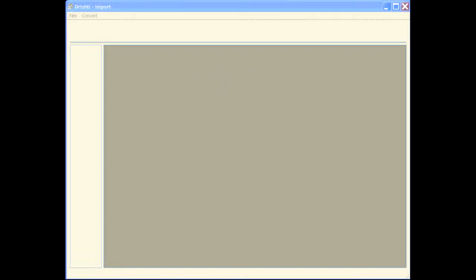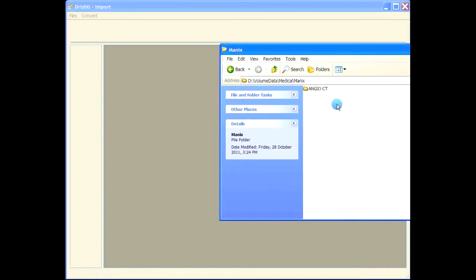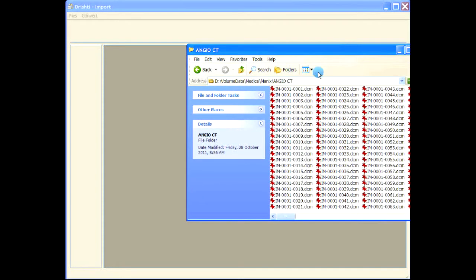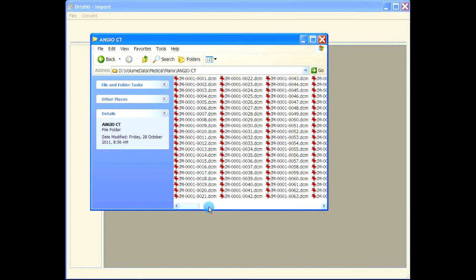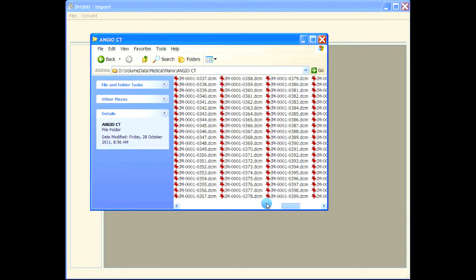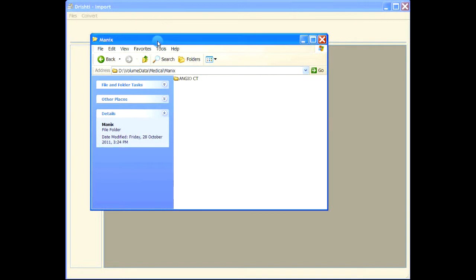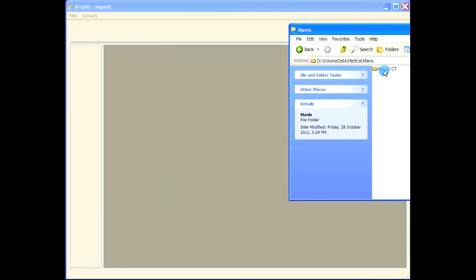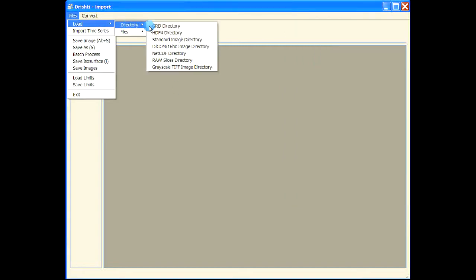This video will show you how to import DICOM image stacks. This is the image stack here, DCM files. We can either drag and drop this directly here, or we can go via load directory and then DICOM or standard image directory.